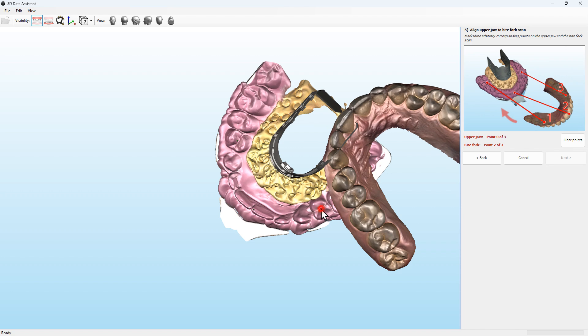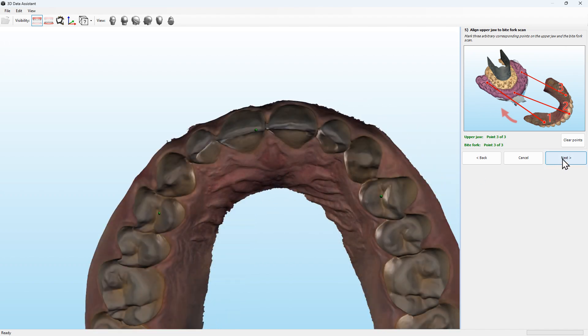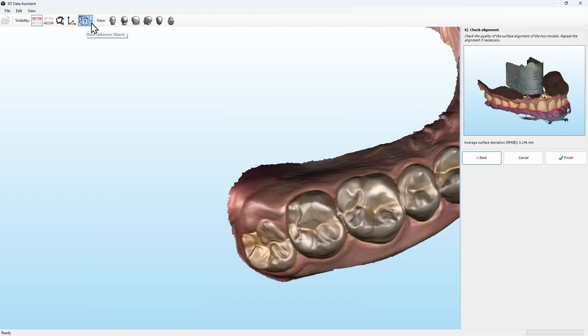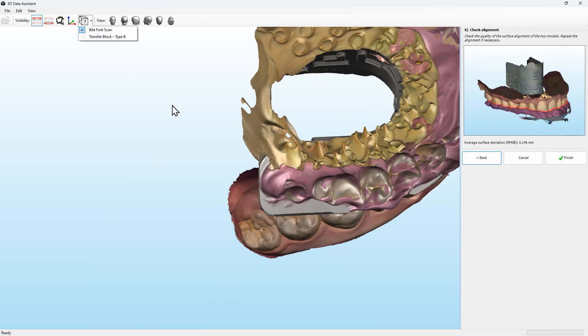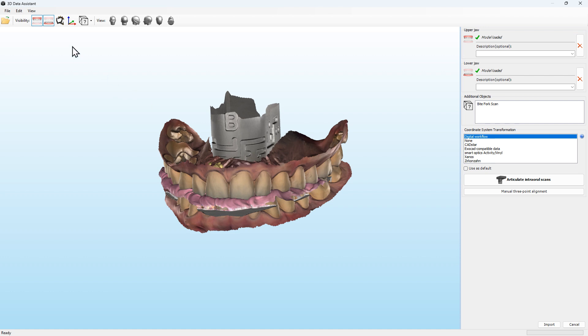The next step is to align the upper jaw to the bite fork scan. By aligning the individual scans together, they can be positioned correctly in the virtual articulator and used for virtual functional analysis.